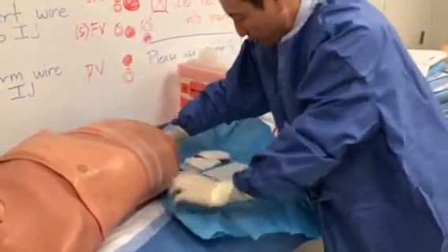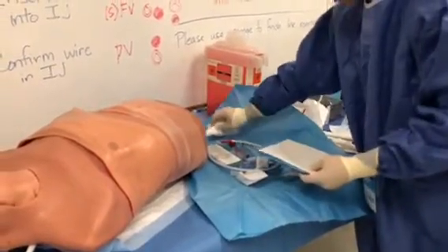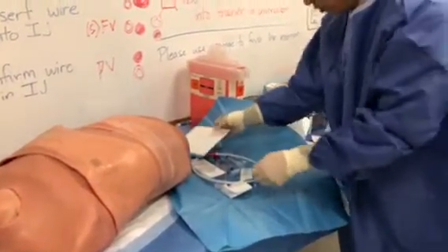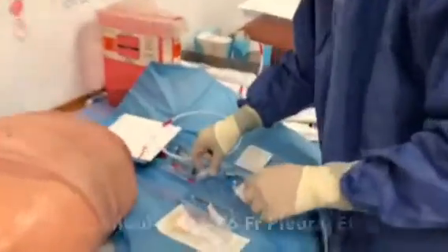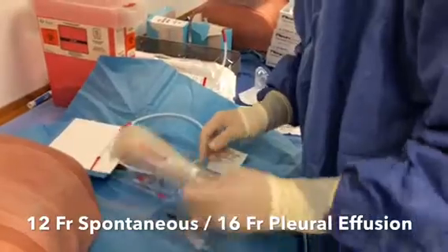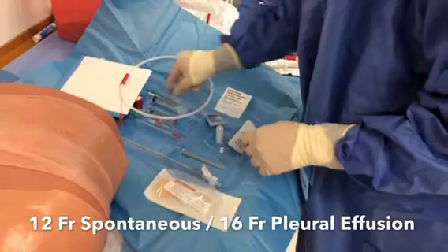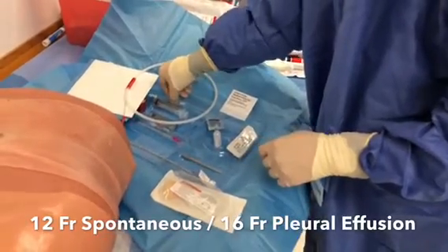We have the quick-pull kit. This comes in 8 French, 12 French, and 16 French. It comes with lidocaine, chloraprep, syringes, needles, wires, serial dilators, and chest tube. This is the 12 French catheter.